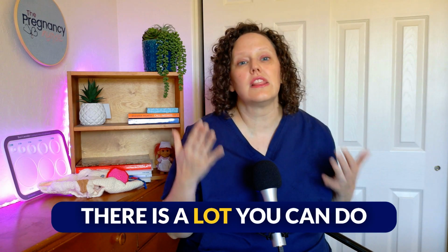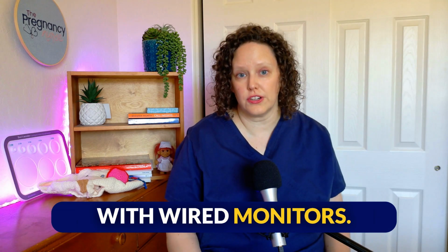Now, if you're sitting there thinking, Hillary, my hospital does not have wireless monitors, I am really frustrated and so sad, I am here to tell you that there is a lot you can do with wired monitors. Now, can you walk around the labor and delivery unit? Probably not, although I think most labor and delivery units have some telemetry monitors, which can allow you to walk. However, those wires are pretty long.